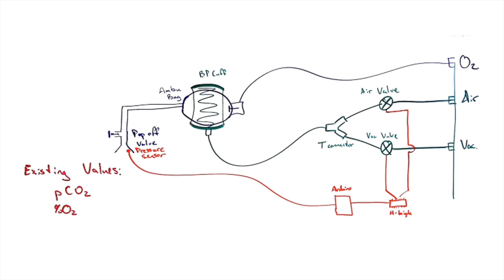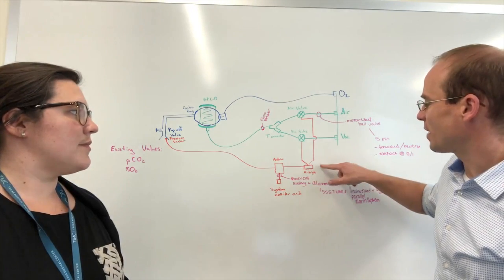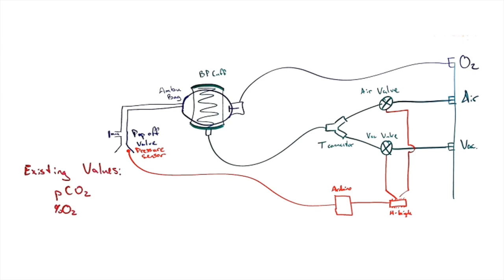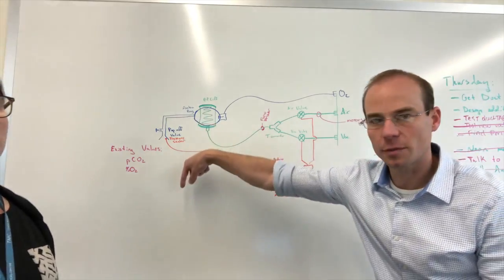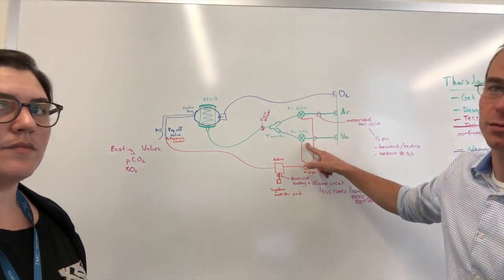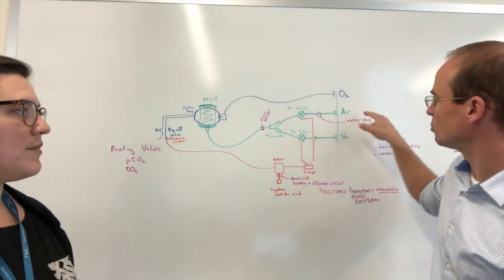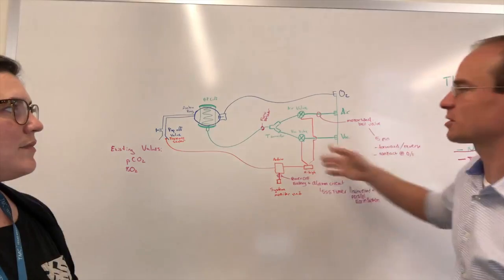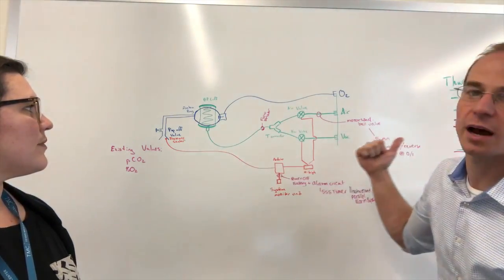The control of those valves, the power is supplied by this H-bridge that's going to be at 12 volts, and that H-bridge is controlled by a microcontroller. Right now we're using an Arduino. So the valve would open, pressurize the blood pressure cuff, squeeze air into the patient, and then to evacuate, the valve closes, the vacuum valve opens, sucks air out of the blood pressure cuff, out the wall, so none of this air, none of the green stuff, actually goes into the patient. It's just going to provide pressure at the blood pressure cuff, and then it goes out the door.